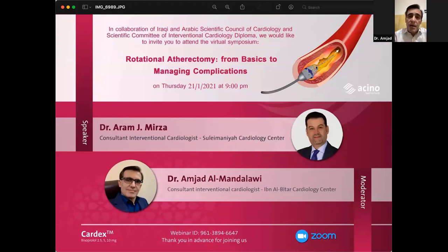And it's wiser, and makes the procedure easier, when you start with rotational atherectomy before balloon dilatation. Dr. Tahsin Kinani is asking if you have any experience with rotablation of a previously implanted stent. Jawad is asking that question too.